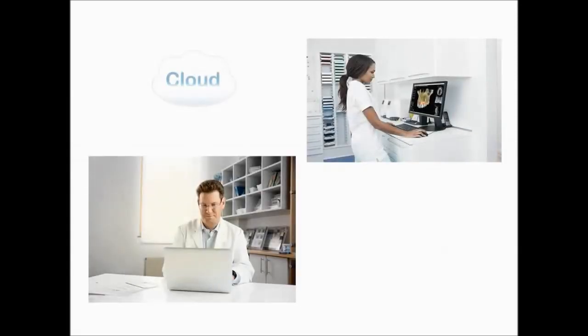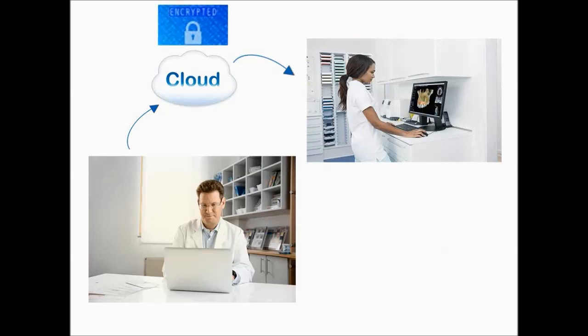CS Connect Overview. CS Connect enables you to electronically transfer intraoral impression data to the lab of your choice quickly and securely through our cloud-based hosted web service. Your data is protected against unauthorized access during transfer and while stored in the cloud. Data is encrypted by your PC prior to transfer and remains encrypted while residing in the cloud.